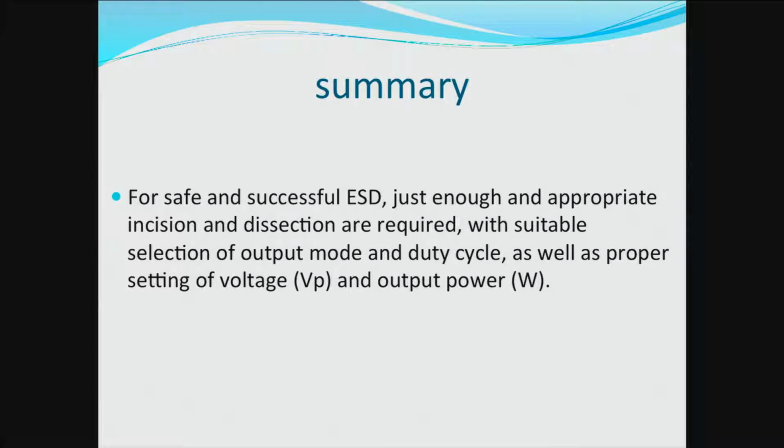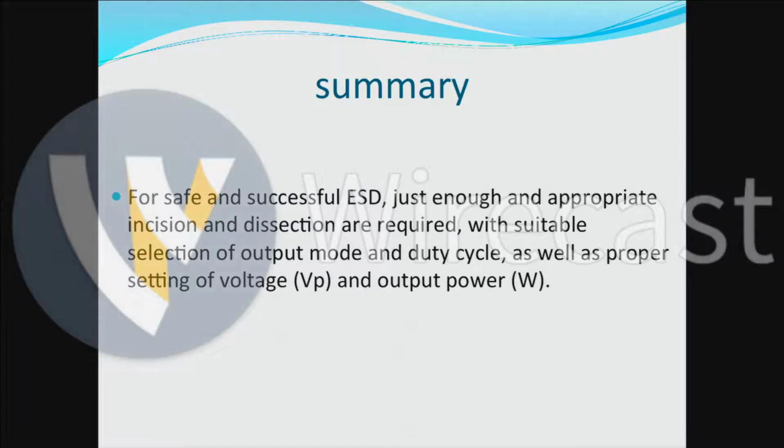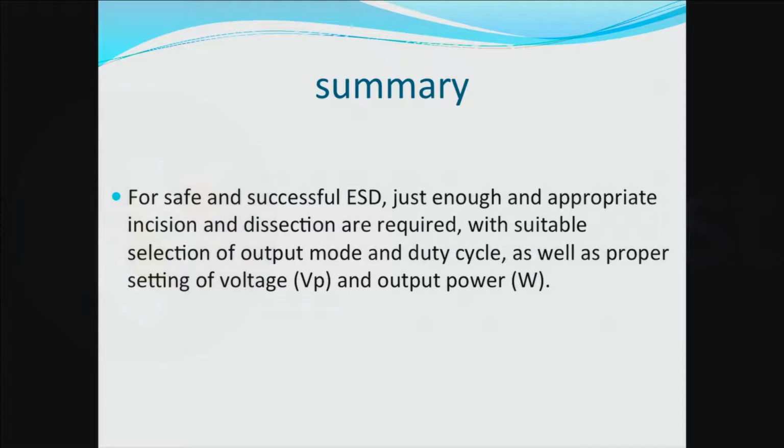It depends on whether the contact is wide or short. If the contact area is wide, some higher power, such as spray coagulation, is required. But when the knife tip is very short and the concentration is very close, we use a more delicate coagulation mode, such as forced coagulation. My professor, Dr. Torinaga, was always basically using forced coagulation because he got very small and tiny steps compared with an IT knife user.